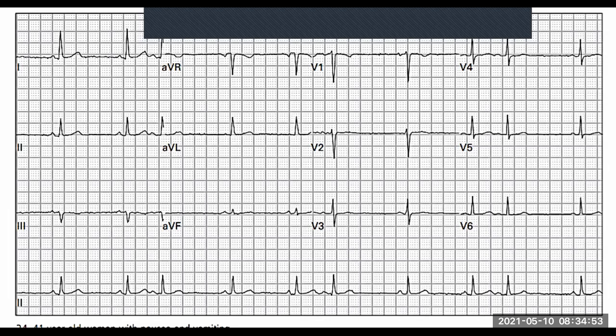So in other words, it could be a cardiac problem that may be leading to the nausea and vomiting. Right? So that's one thing. Now, of course, this is in conjunction with all of your other parameters, pregnancy test, overall physical examination. Remember your ECG, you don't see a patient and put on an ECG. This is after your physical examination. So you may already notice something.